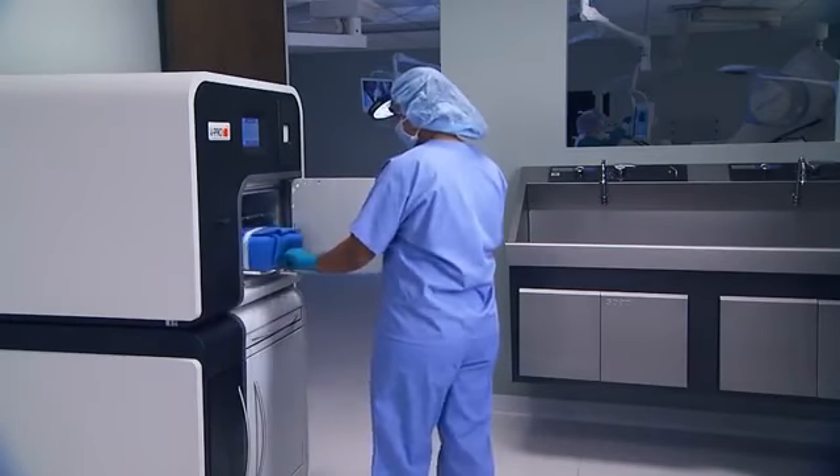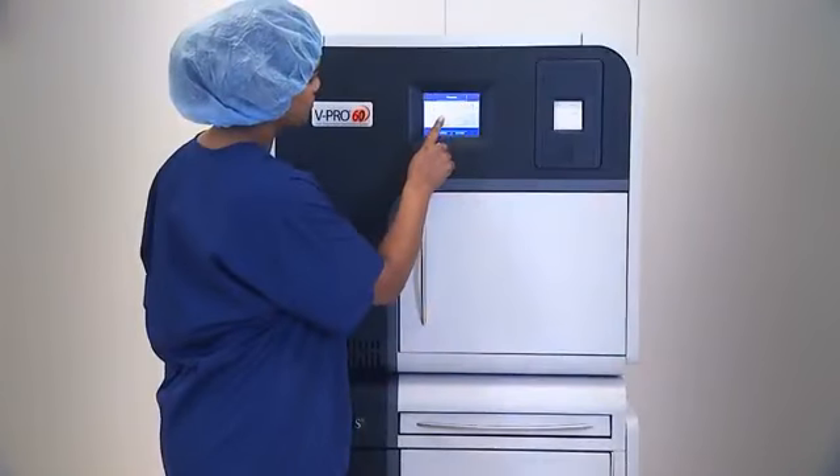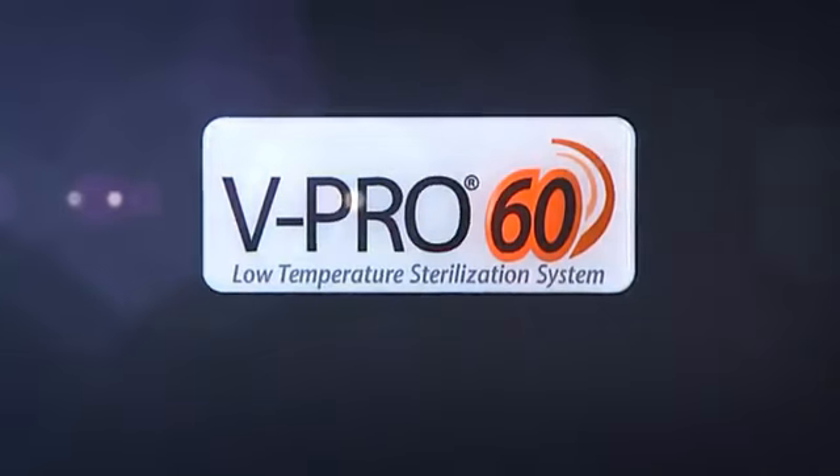From the leader in infection prevention solutions, introducing the newest member of the vPro product line: the vPro60 Low Temperature Sterilization System.